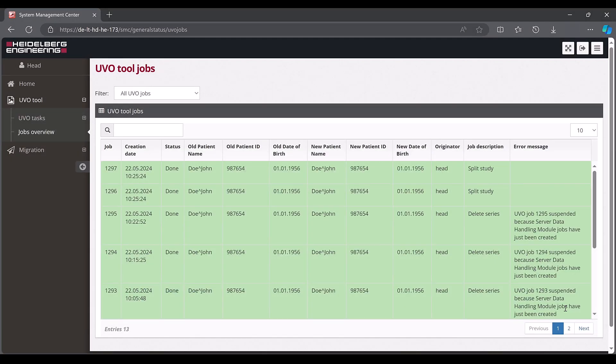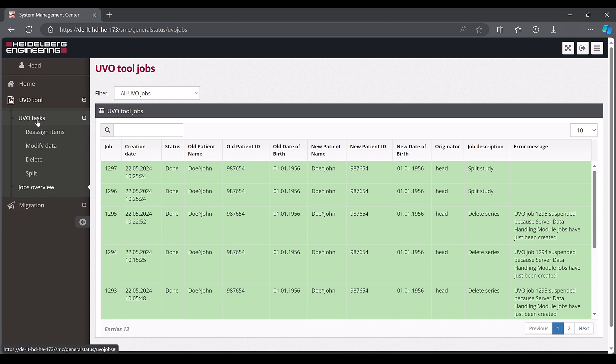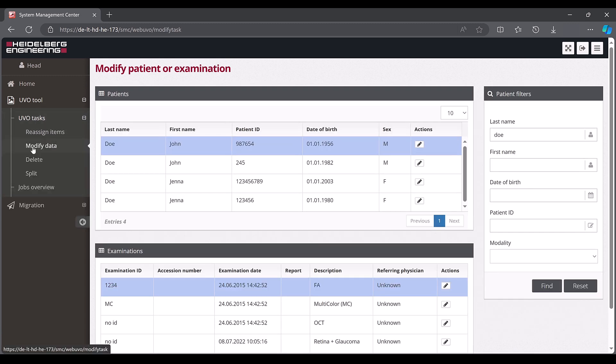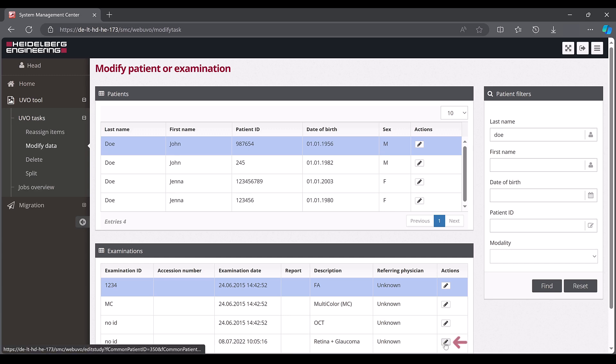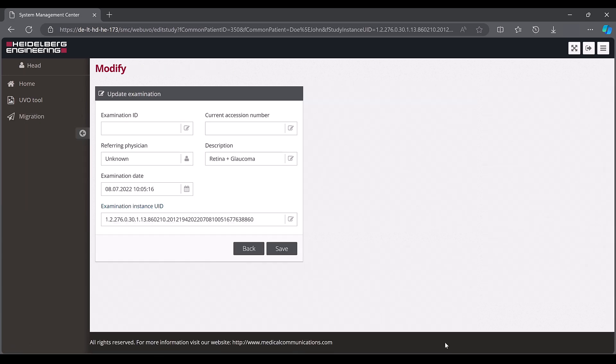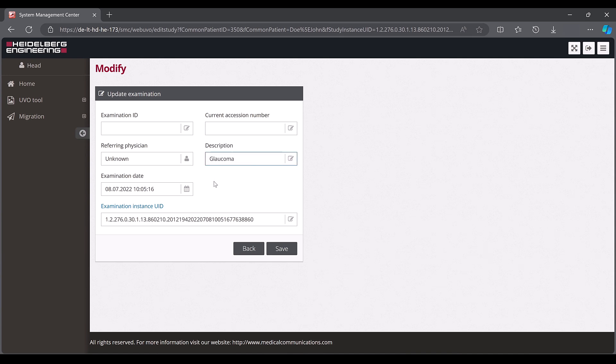To adjust patient data, such as an examination description, click modify data within the UVO tasks area and filter again for our patient with the surname Doe, if not already displayed. If you want to change the examination description from July 8th 2022 to glaucoma for John Doe, for example, click the pencil icon. Remove Retina as well as the plus sign and confirm with save.